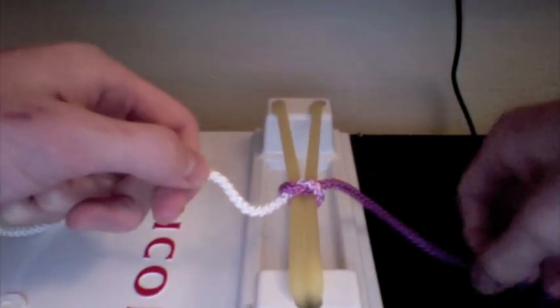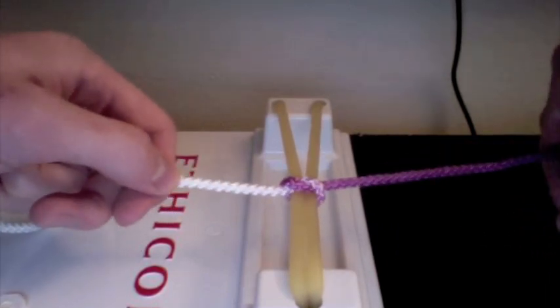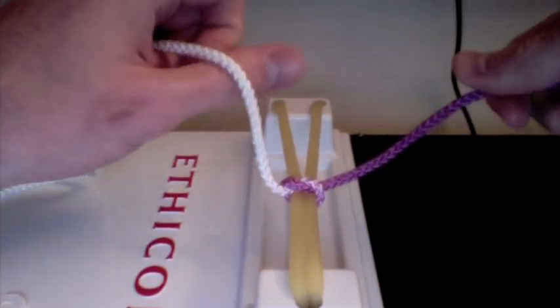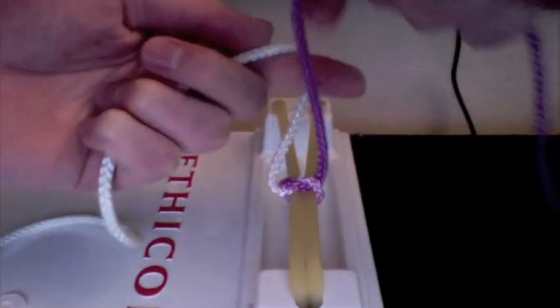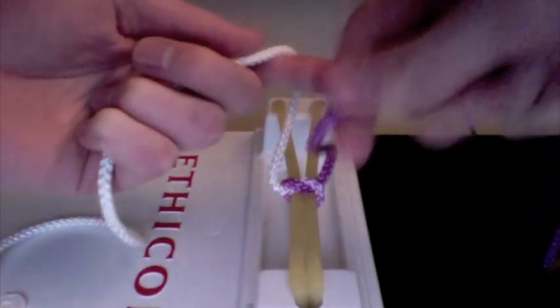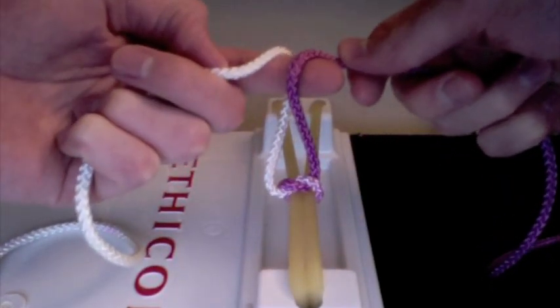The second part of this move is the first part in reverse. Instead of making a loop over the thumb, we're actually going to make a loop over the first finger. Again, we want the purple and white strands to be going in the opposite direction, so I'm going to lay my purple strand going away rather than coming towards like the white strand.